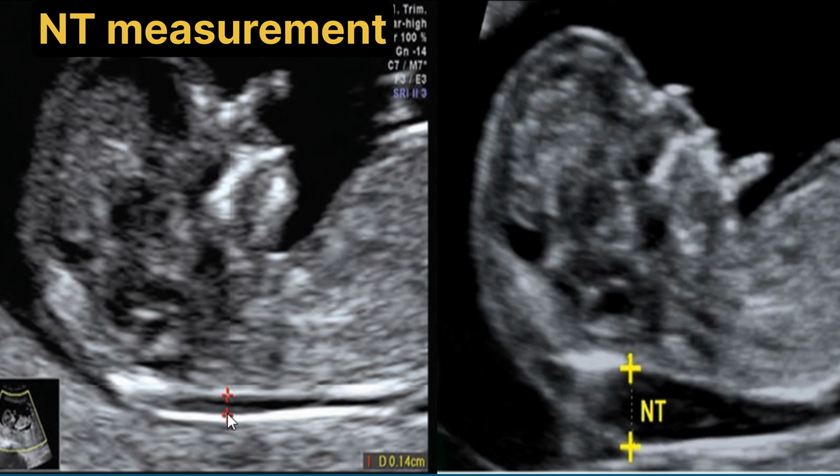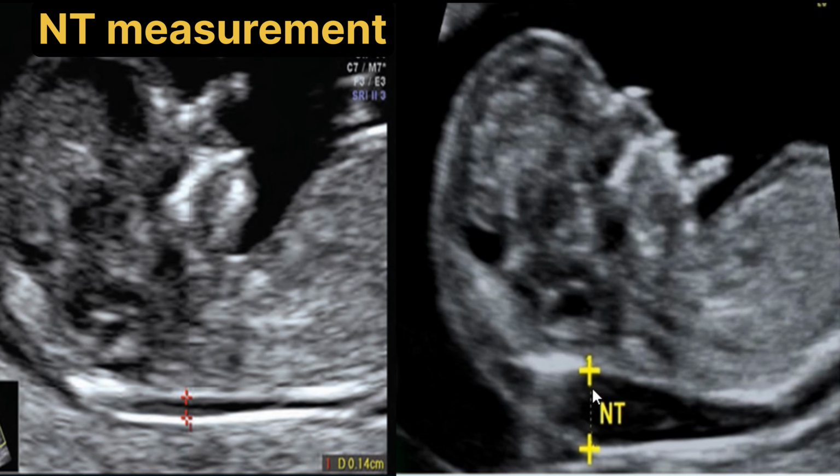Greater than 3 mm leads to the chromosomal abnormalities. Now in the sonogram we can see the increased measurement of the Nuchal translucency, which is about 0.5 centimeter, which is greater than the normal Nuchal translucency, which lies less than the 3 mm.